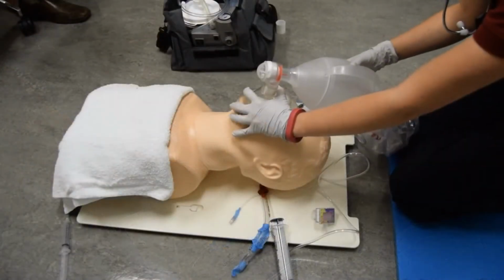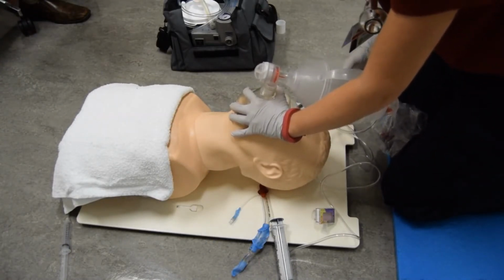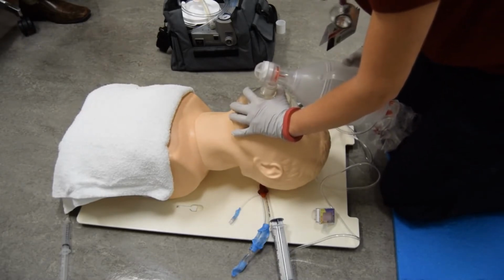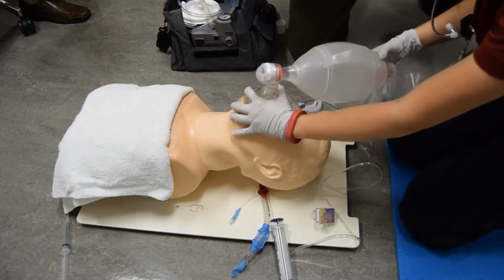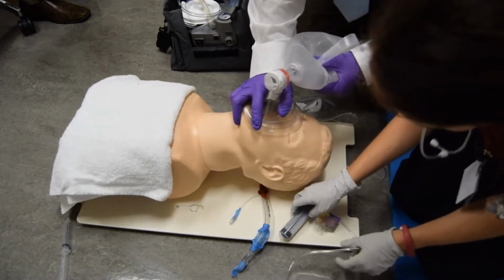After 30 seconds, examiner auscultates and reports breath sounds are present and equal bilaterally, and medical direction has ordered insertion of a supraglottic airway. The examiner must now take over ventilation. Directs assistant to pre-oxygenate patient. Can you pre-oxygenate the patient, please? Sure. Checks, prepares supraglottic airway device.